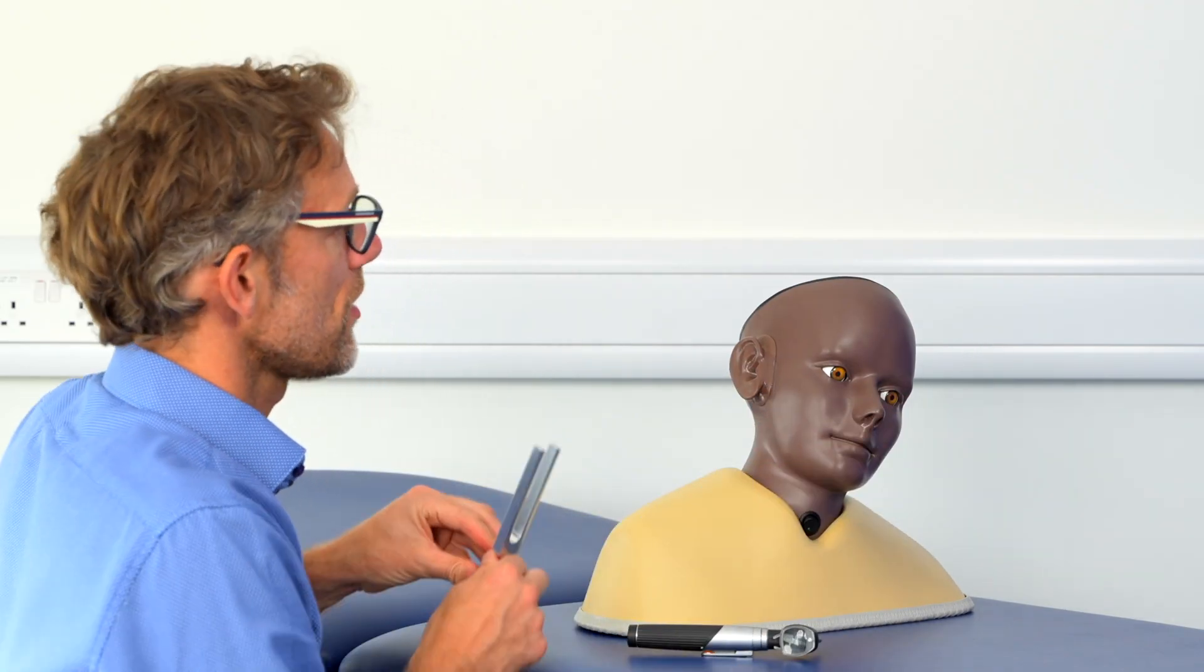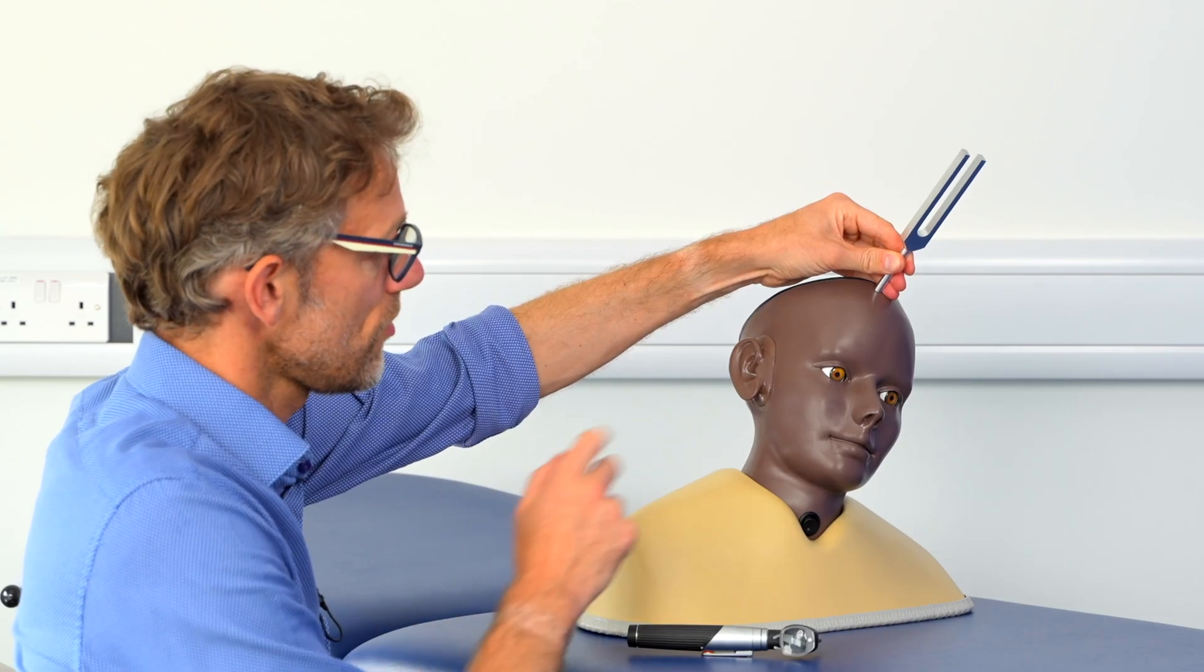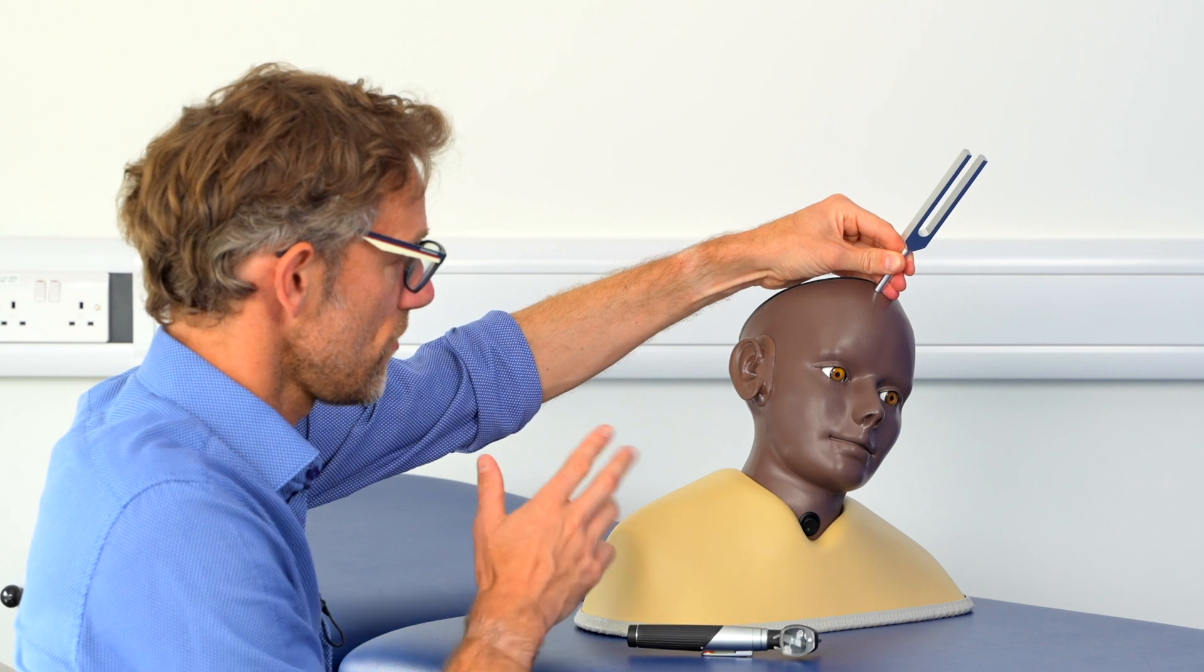Now we're going to complete by checking with the tuning fork at the centre of the head. Can you hear it in the left or the right ear, or centrally? Centrally, fantastic.